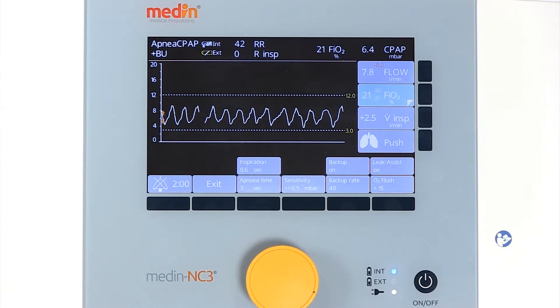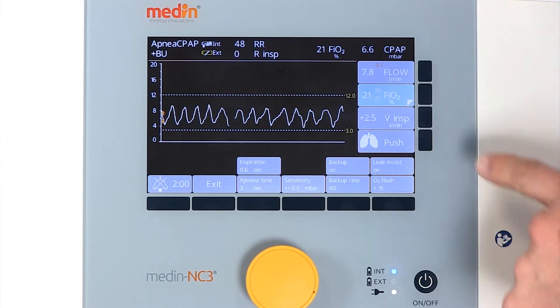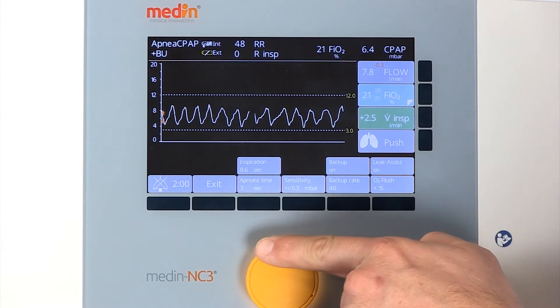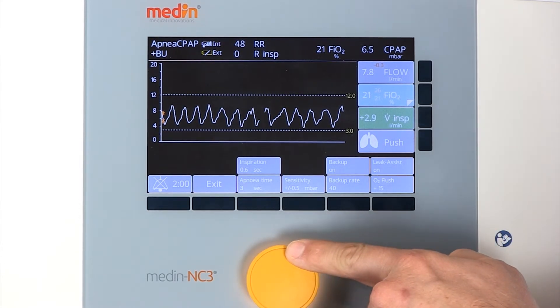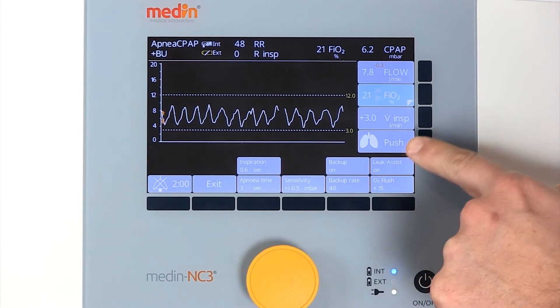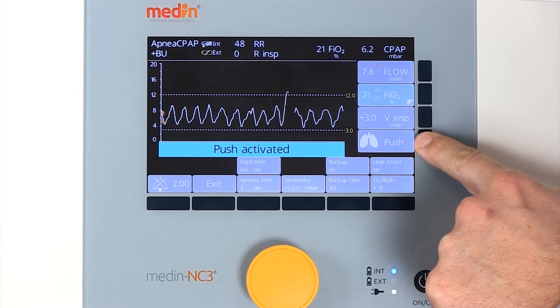The Medin NC3 is also able to apply additional manual breaths, which you can adjust if necessary. The maximum inspiratory time is 3 seconds.